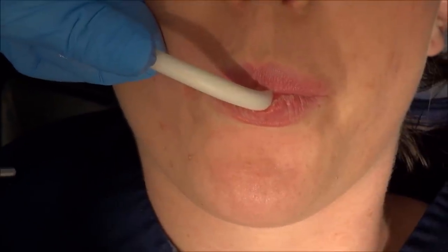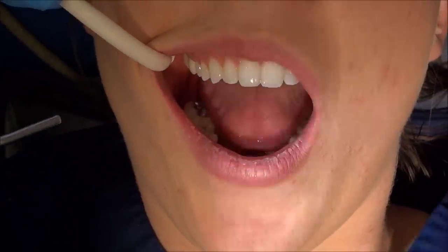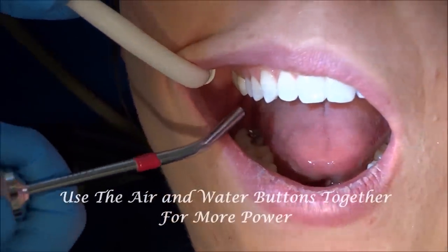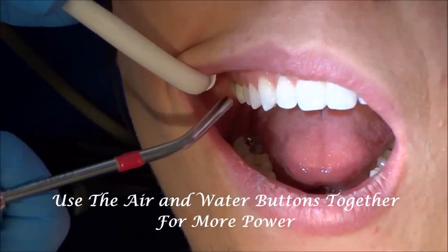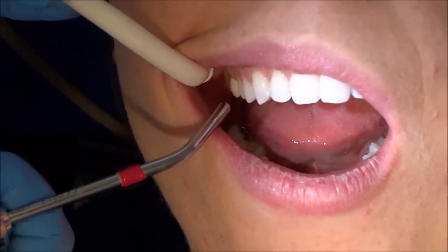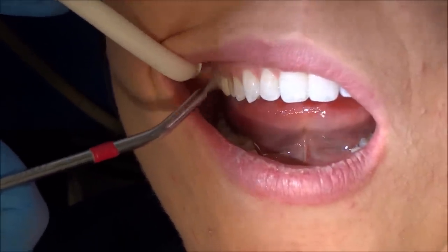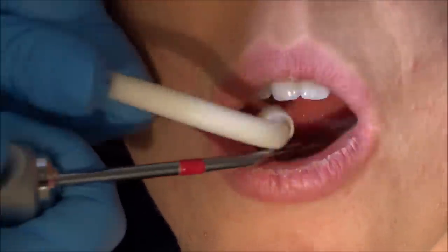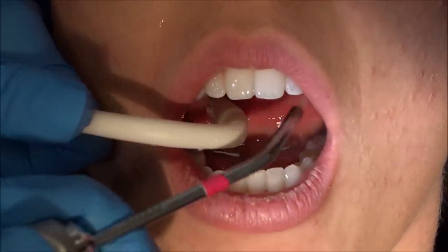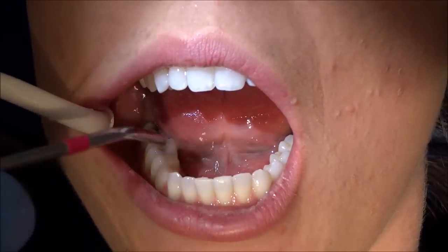Just run it along all the teeth so it doesn't deflect in the wrong direction, and close your lips on that. If you have an area that's being stubborn and debris is not coming off, you can use the air and water buttons at the same time. I'll start with a little bit of water and then add the air in — that will help blast away any debris that's not coming off. You can do big circular motions or a back-and-forth motion.